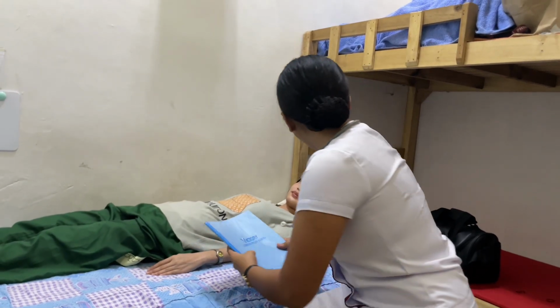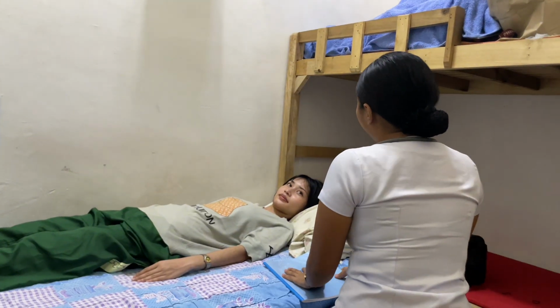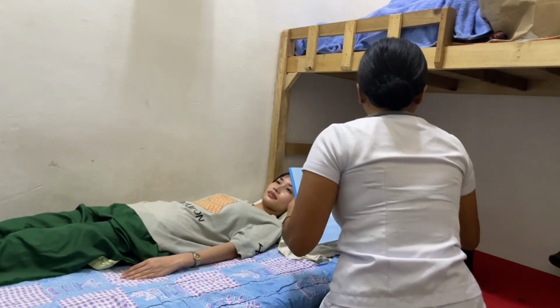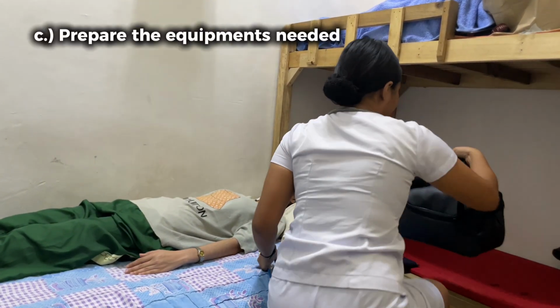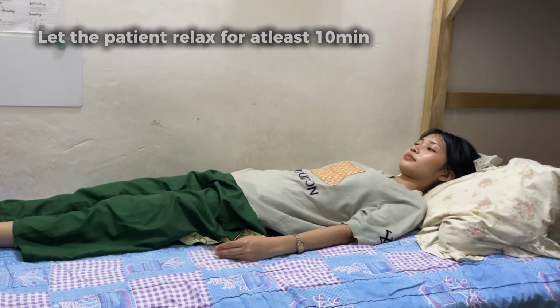So today we will be doing the ankle brachial pressure index test, which means I will be getting the pressure of your arms and legs. Before we proceed, I will just get all the equipment needed, and while I'm getting it, you can just relax and wait for me, and I'll be back.